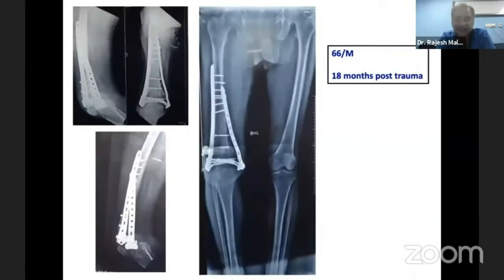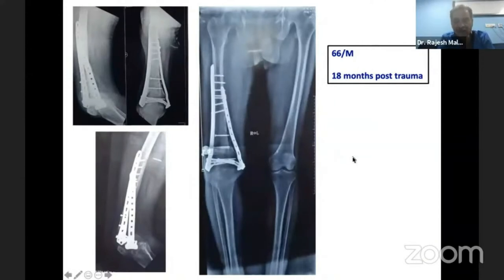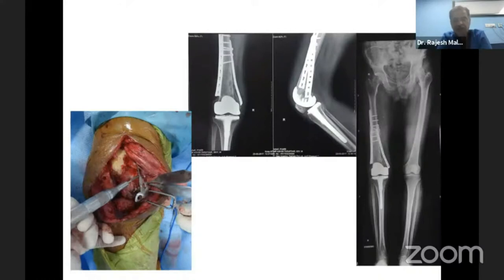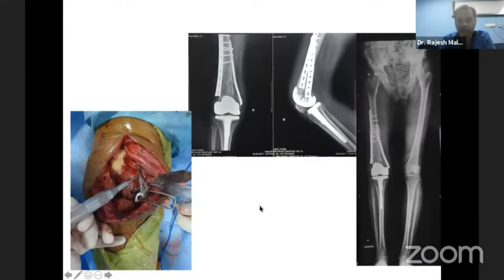Here is an example — a 66-year-old male, 18 months post-trauma. If I were to remove all these plates, I would have stress risers extending the full length. As they say, give a difficult task to the laziest person and they'll find a shortcut. So what we did was remove only the screws from the distal part, used a metal-cutting tool to cut the plate, and then used a handheld accelerometer-based navigation system. I didn't need an intramedullary rod. You can see the alignment, and this kind of surgery can be done quickly without causing too much damage or blood loss.